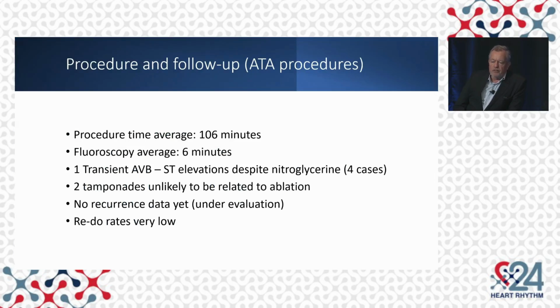In terms of safety, we had 1 transient AV block ablating on the anterior mitral isthmus, 4 cases of ST elevation despite nitroglycerin, but that was managed without clinical incidents. 2 tamponades, unlikely to be related to ablation. We have no recurrence data yet. Unfortunately, it's under evaluation, but we have noted that redo rates are very low.